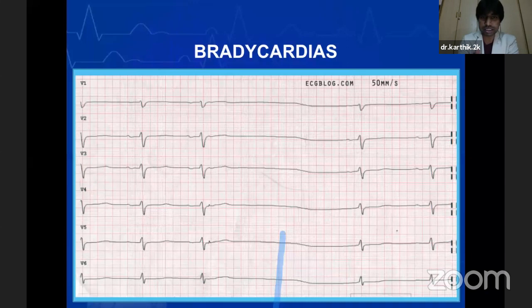Okay, so there is a sinus node problem, and at the same time, there is a failure of conduction of impulse at the sinus node junction. Only thing, this ECG paper, if you see, was taken at a higher paper speed, that is 50 millimeters per second. So if it was at a traditional speed, probably it might have been even more prolonged.